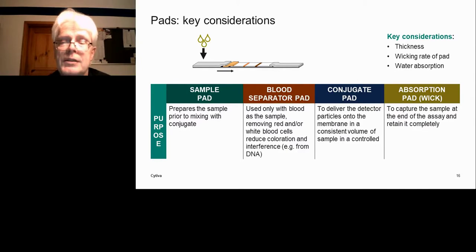And then you expect, after a year of storage in a drugstore, a household, a doctor's office, under more or less dubious environmental conditions, that the conjugate pad, when the sample enters, releases this dry conjugate into the sample and makes it run across the test.